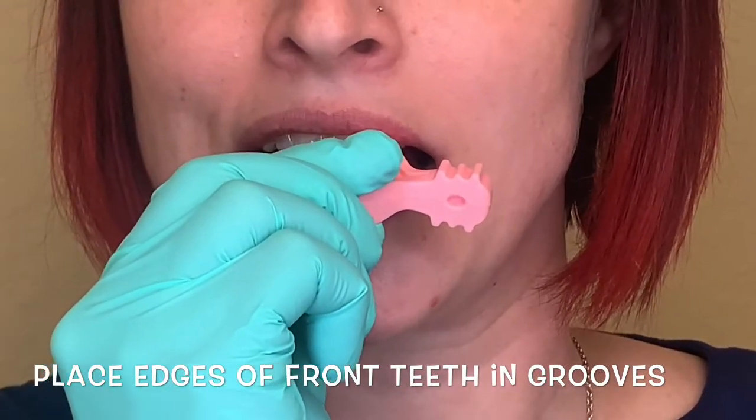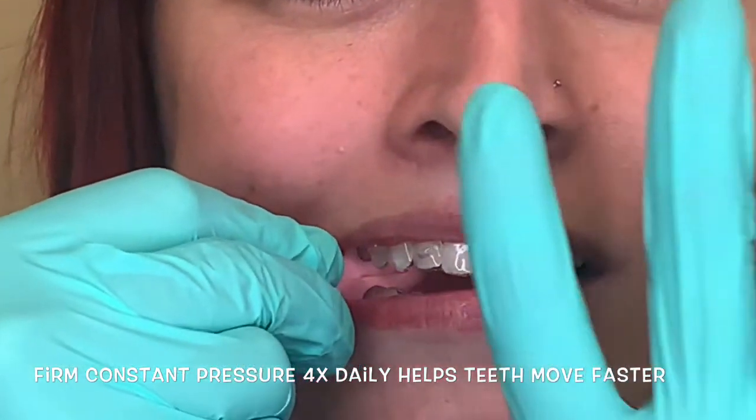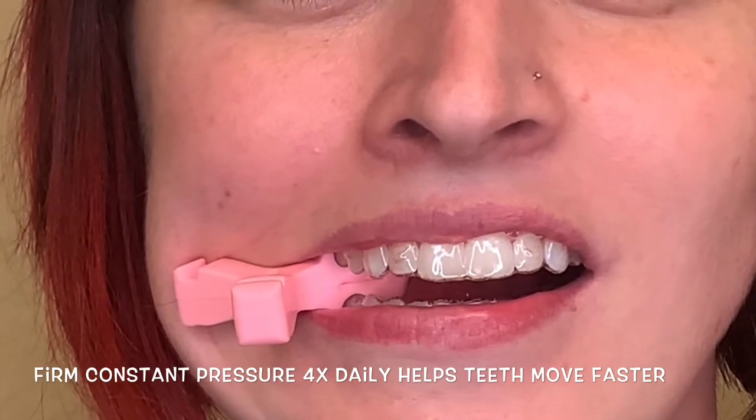You'll do this every single time you put your aligners in. Four times a day you're going to apply constant pressure for 15 minutes. Yes, that's an hour out of your day.